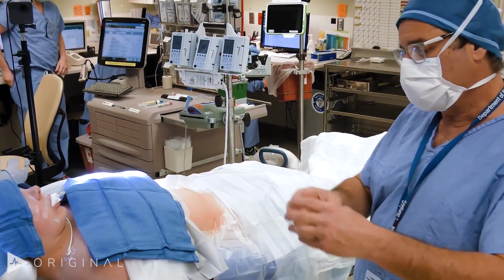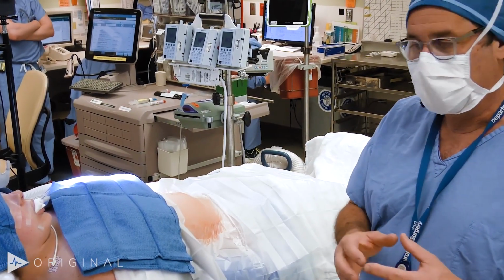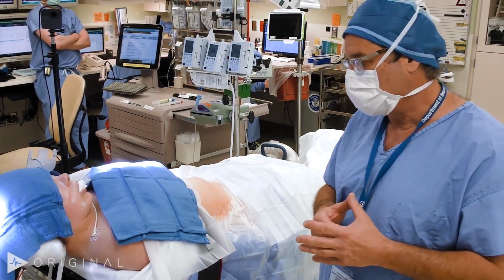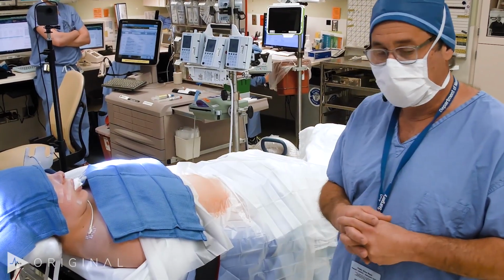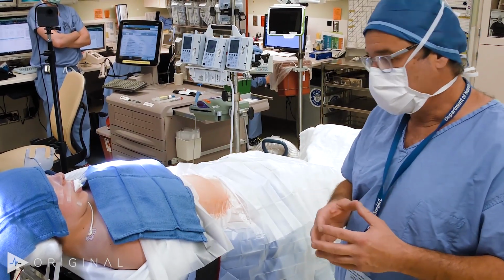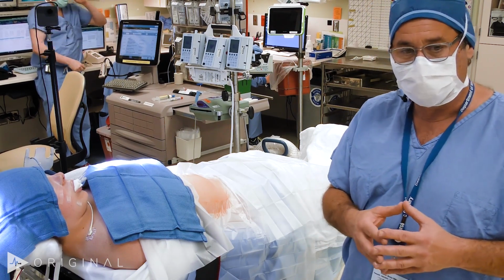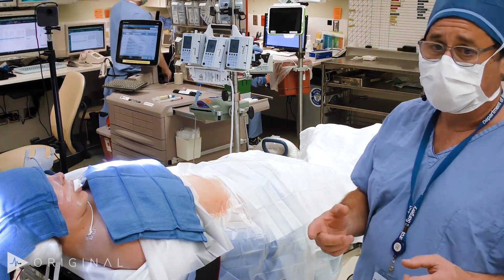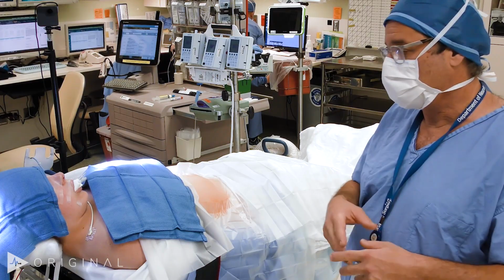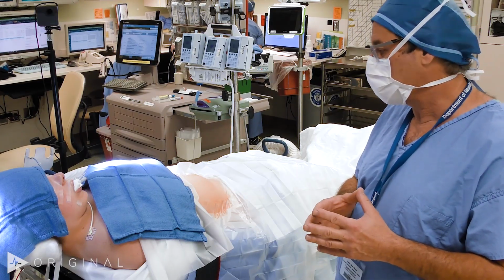On her MRI, though, the tumor feathers from the right into the left, which emphasizes that, during surgery, because she's a young woman in particular, we want to really try to preserve the anterior pituitary gland in case in the future she wishes to have children. As we know, you can get children without a pituitary gland with the assistance of a good endocrinologist. But if you have a pituitary gland that's intact, it's surely much easier. Of course, we want to preserve the posterior gland to prevent diabetes insipidus.